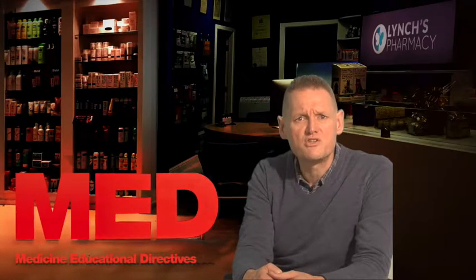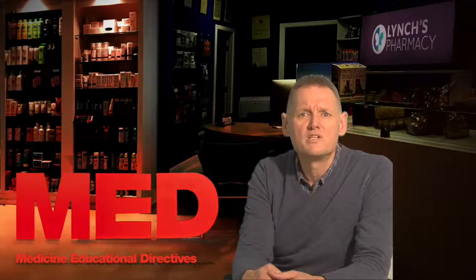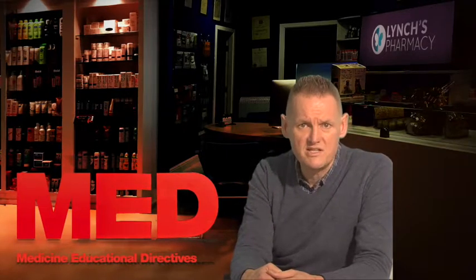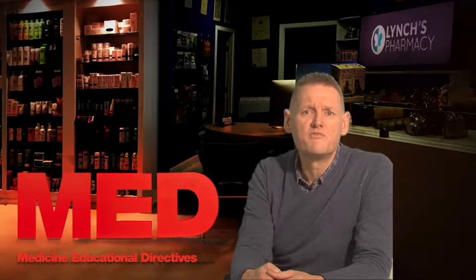Each time you inject your insulin, make sure you use a different site. This helps to prevent the skin thickening and pitting, which can occur if the injection is repeatedly given in the same site. You should measure your blood sugar levels every day when using insulin injections. The dose you need to inject each time will depend on your blood sugar levels, what you are going to eat, and if you have been doing or will be doing exercise.